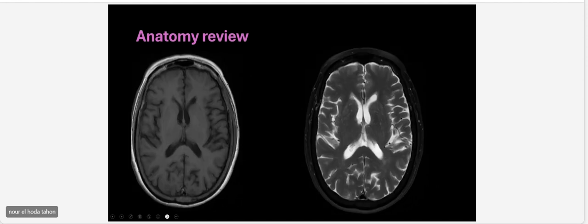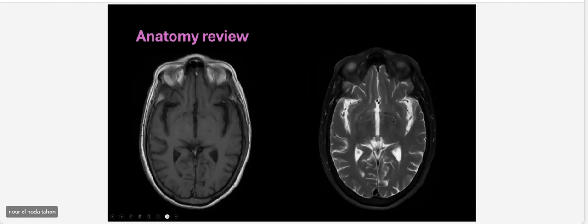So every vessel has a space of CSF surrounding it. Sometimes it's prominent, and you can always see it in this area. Why can I say this is perivascular? It's linear. Here, there, here, right? It's linear, and it goes in the same direction as the blood vessels.